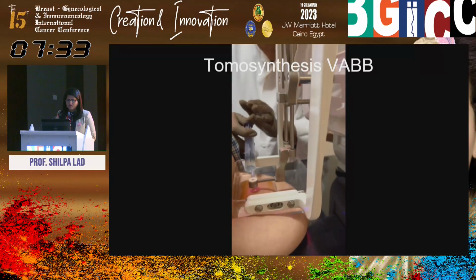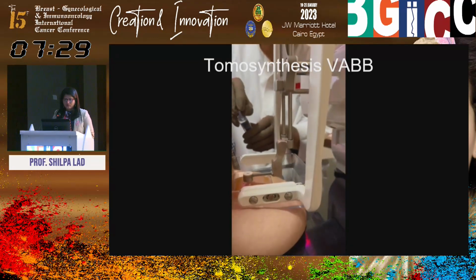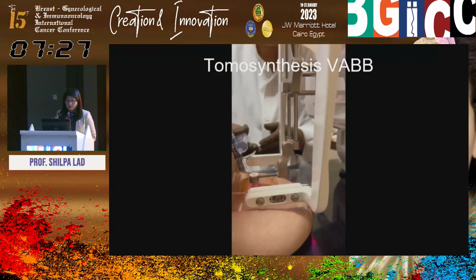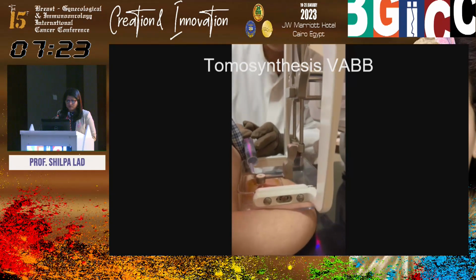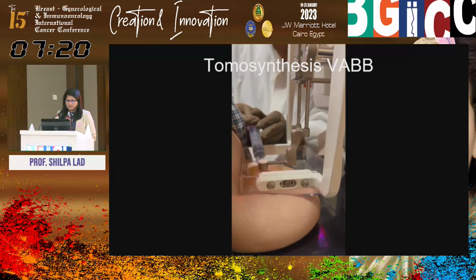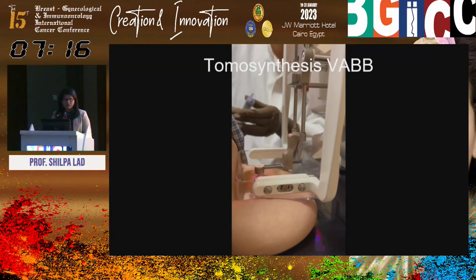Okay, are you with me so far? Are you okay? Very good. If there is any pain or any discomfort that you feel, please indicate by raising your hand. Okay, now I'm going to go deep into your breast. Okay, I'm going in deep. You're going to feel a small burning sensation. Try not to move. Are you well? Are you okay?